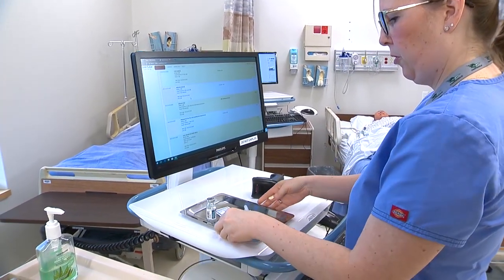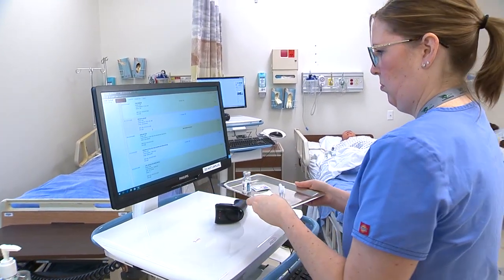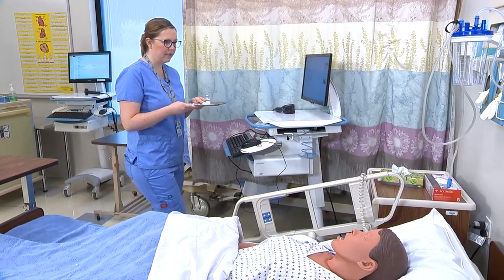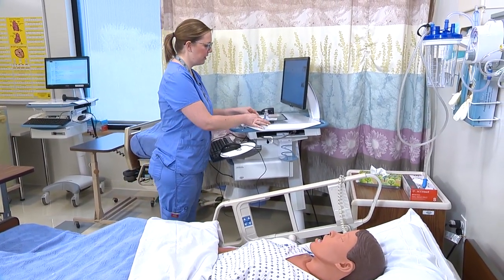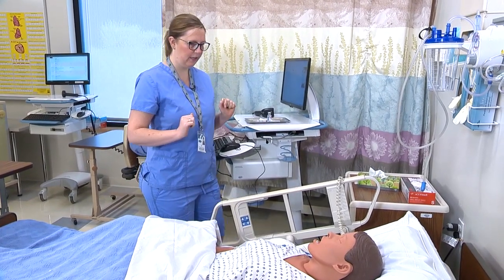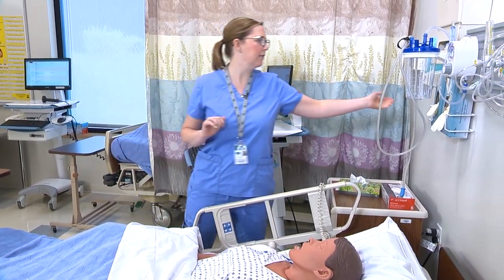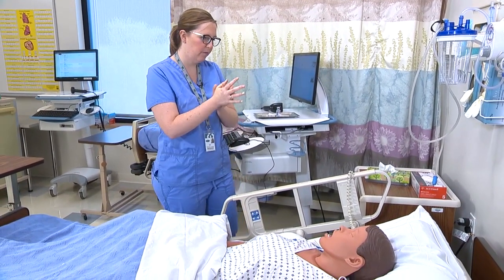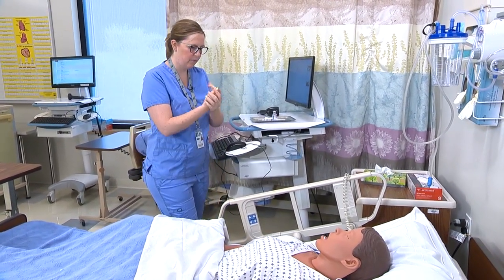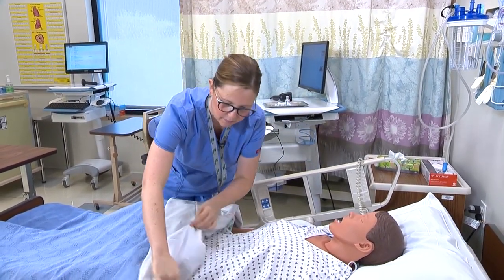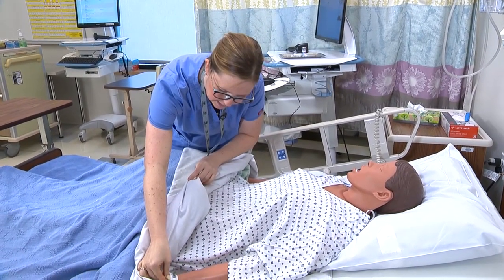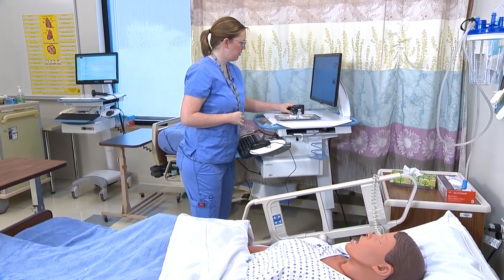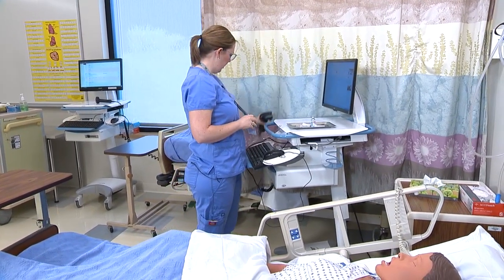Now I'm going to the patient's room. Hi Morgan, it's Sarah your nurse. I'm here to give you your pneumonia vaccine. How are you doing today? Can you tell me your name and date of birth? Morgan Brown, August 4th, 1970. Okay, that's what I see here. So your doctor ordered for you to get the pneumonia shot.